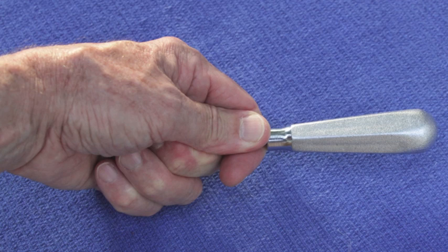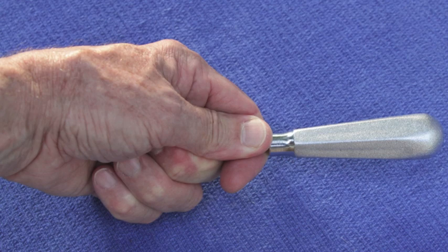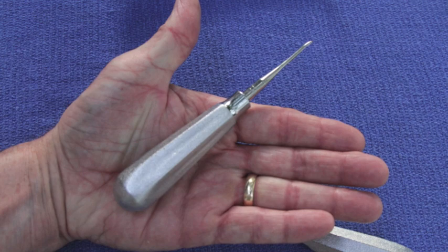In these images, you can see how the assistant is to hold the elevator. They are to hold it from the working end, presenting the handle to the surgeon. In the next image, you can see how the surgeon is going to be holding it. And so when the assistant places the instrument into the palm of the hand, the surgeon will then grab it, and then the assistant can then let it go.